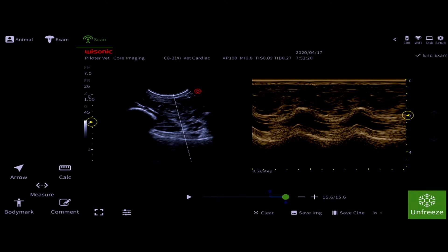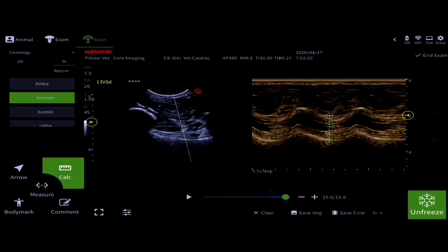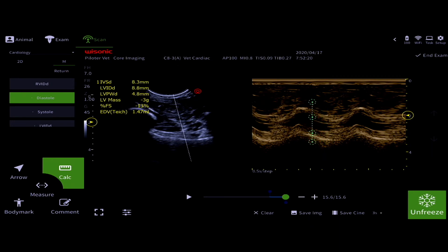Hit the calc button and your cardiac calculations will appear in the left menu. Hit diastole and put your four points where you need them to be on the M-Mode display.